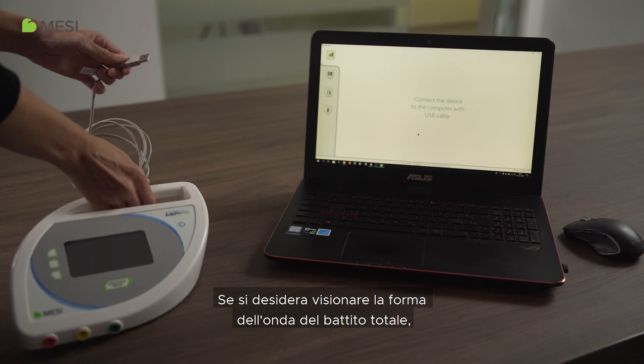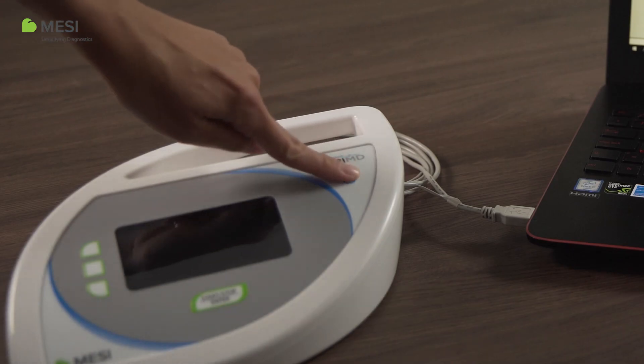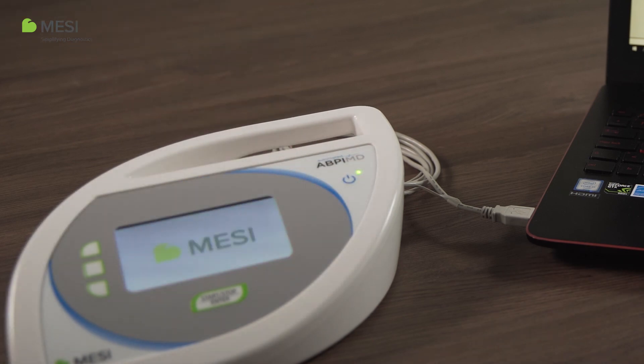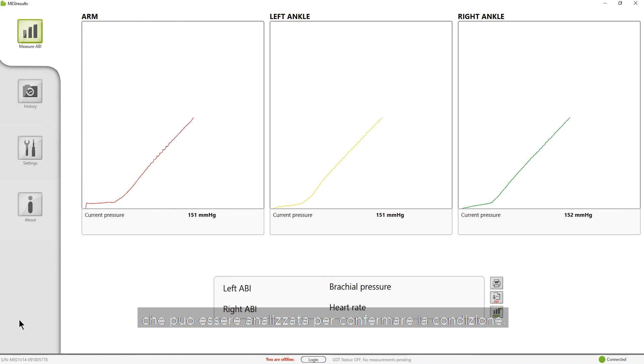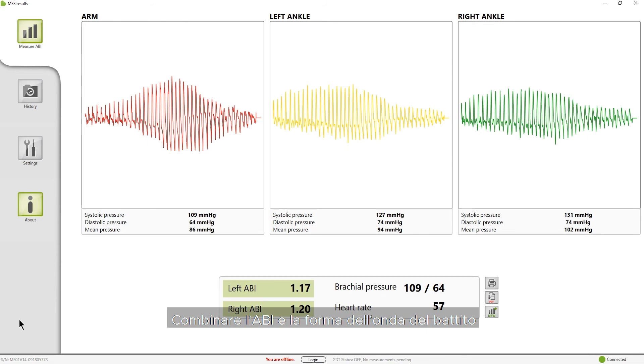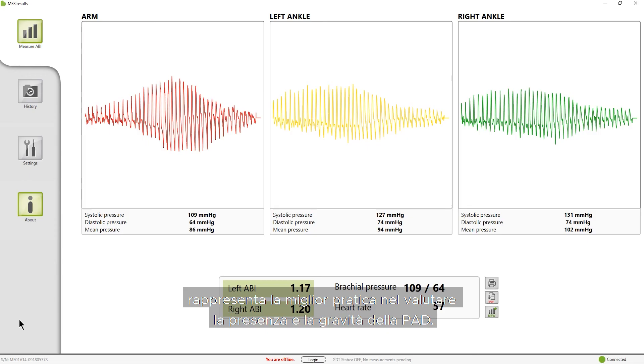If you would like to view the full pulse waveform, repeat the measurement with the device connected to the computer. This provides the full-length pulse waveform recording, which can be analyzed to confirm the condition. Combining both ABI and the pulse waveform recording represents the best practice in evaluating the presence and severity of PAD.